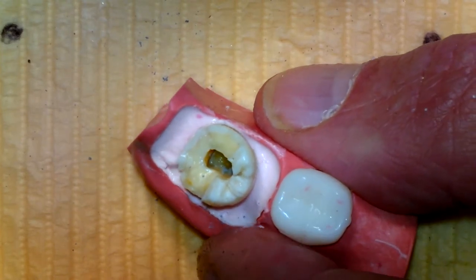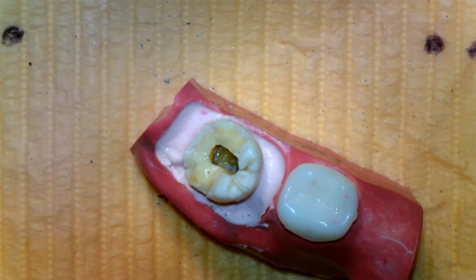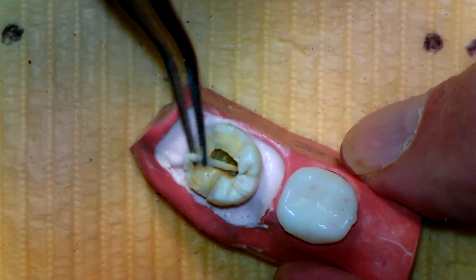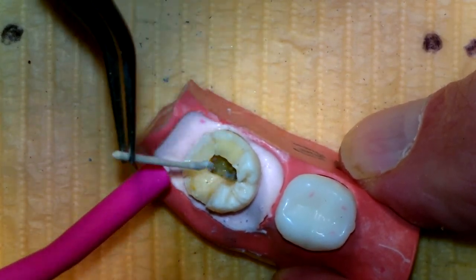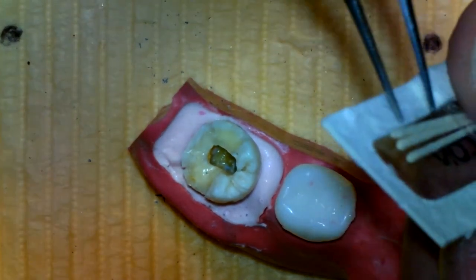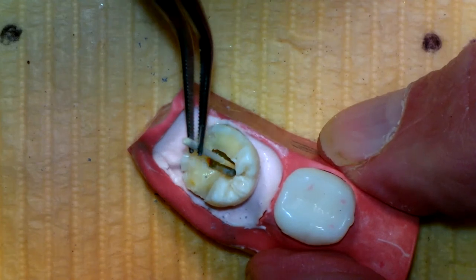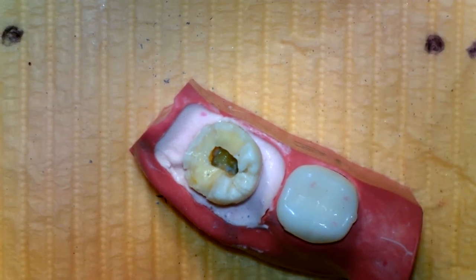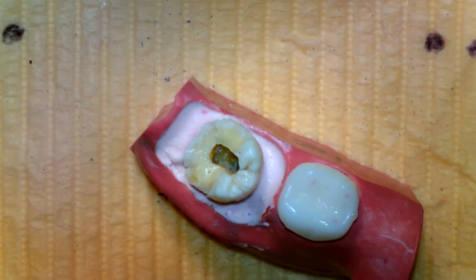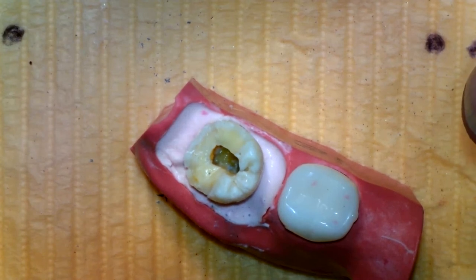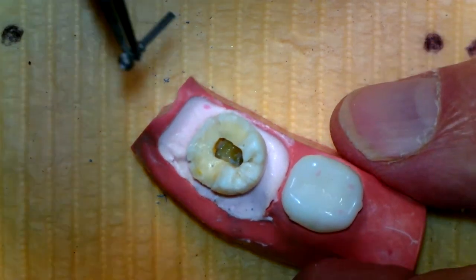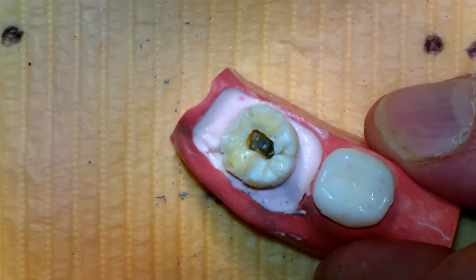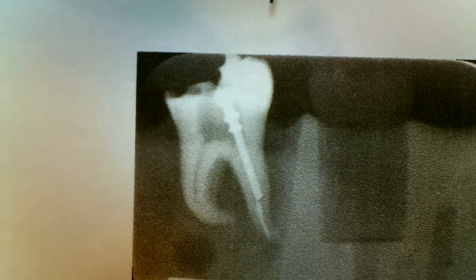Now, because we've had a rubber dam on, we're going to dry the canal and make sure there's no moisture to mess up the set and the bonding. Just like we did before, we're going to take a picture of the tooth with the post in to see how it sets up before we cement anything. Here's a picture of the post fitting in the tooth — this is a 4½ post and it went fairly easy without much work.